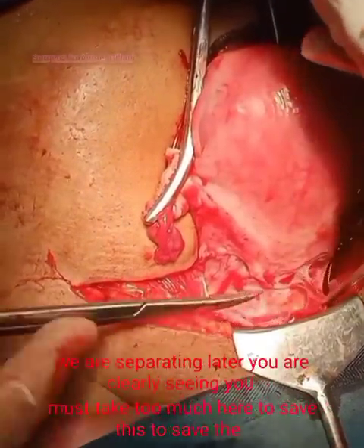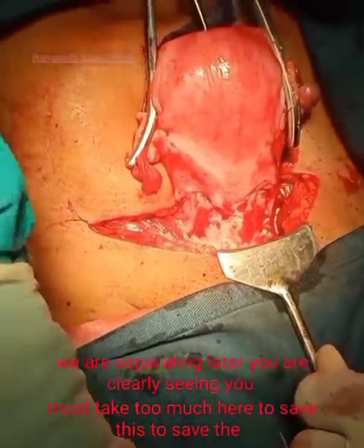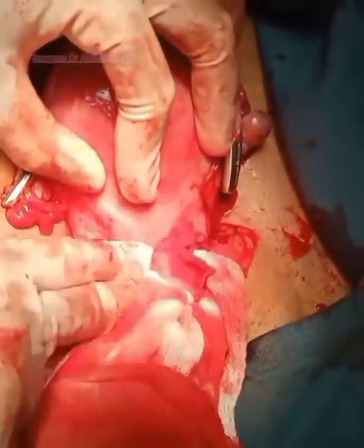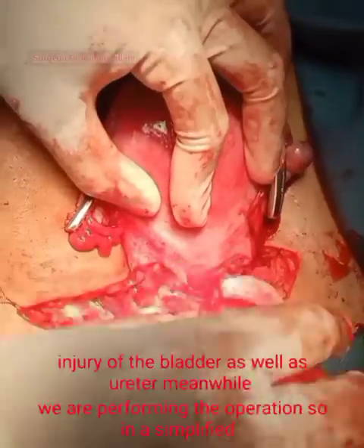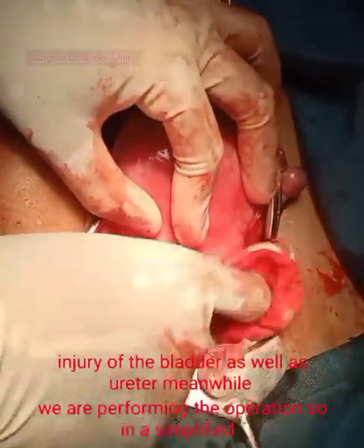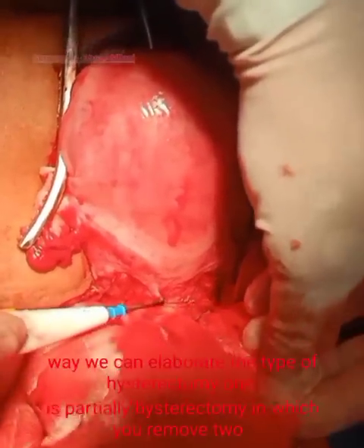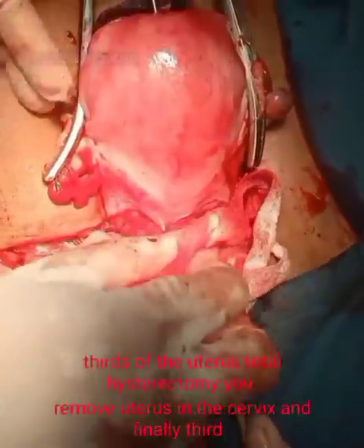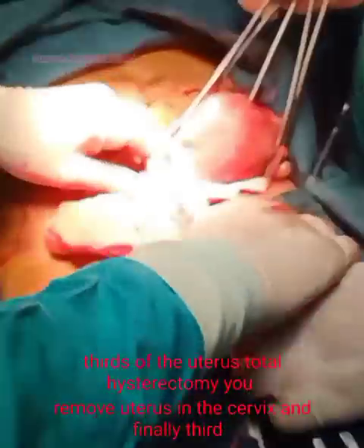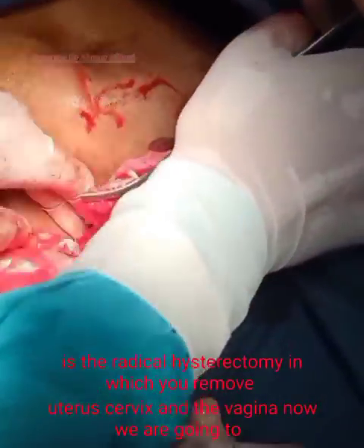We are now separating the bladder, taking great care to avoid injury to the bladder and ureter. In simplified terms: partial hysterectomy removes two-thirds of the uterus; total hysterectomy removes the uterus and cervix; and radical hysterectomy removes the uterus, cervix, and vagina.